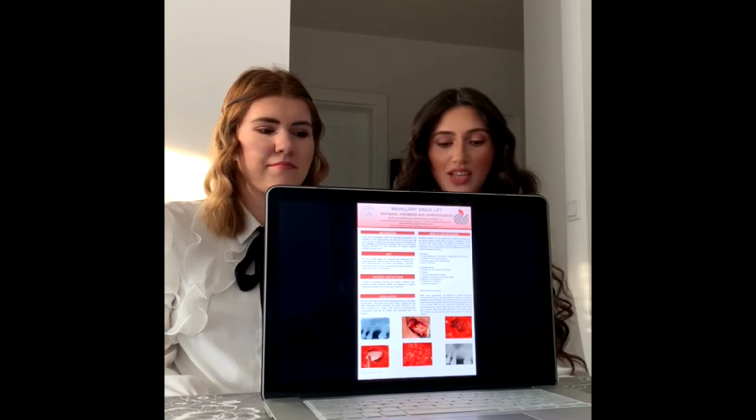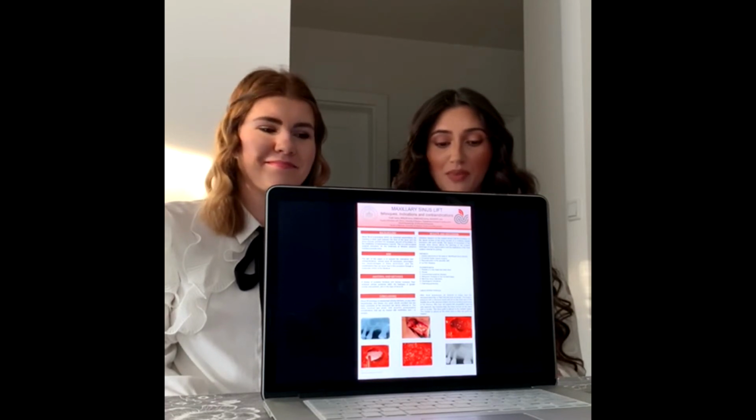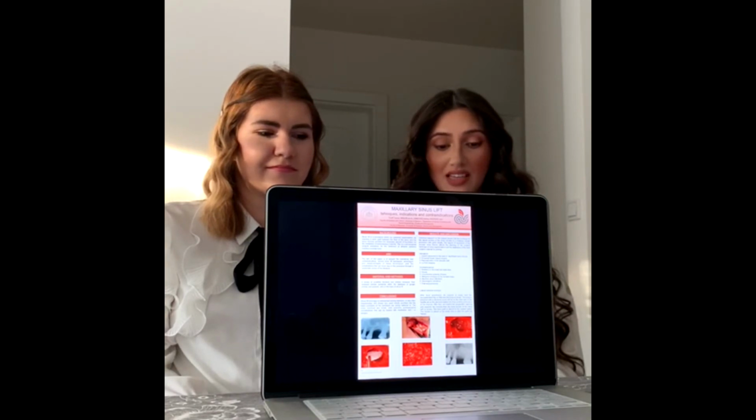The lateral window technique is as follows: after local anesthesia, an incision is made, the mucoperiosteal flap is lifted and the bone is shown. The bone is prepared with a diamond drill bit on the front wall of the maxilla above the planned implant site, thus avoiding perforation of the mucosa. After that, we expand the preparation opening and separate the mucosa from the bone bottom of the sinus with a curette. The bone graft is placed in the created space. The implant is placed at the same time or after the graft has healed.